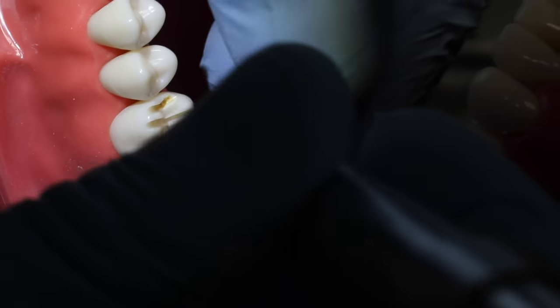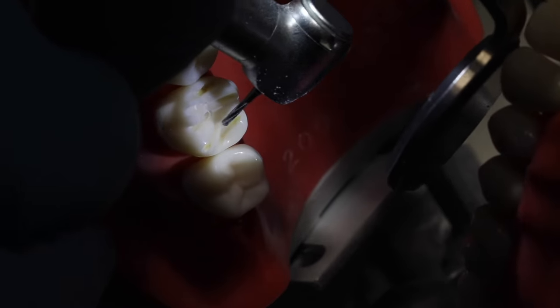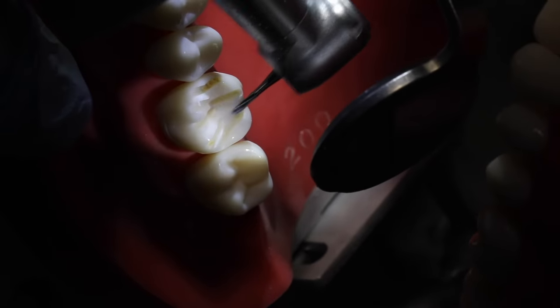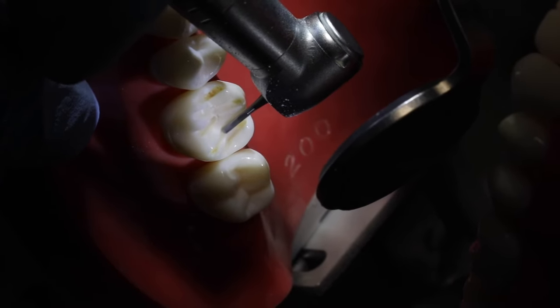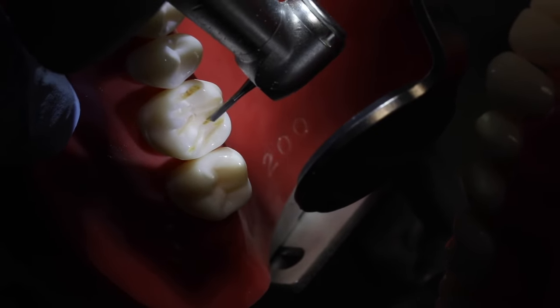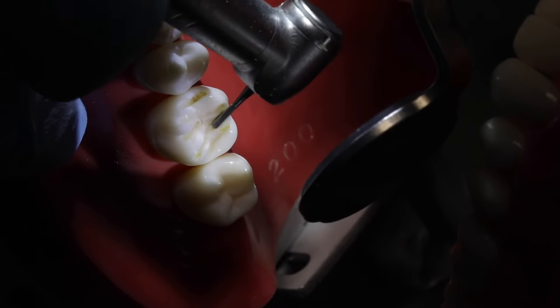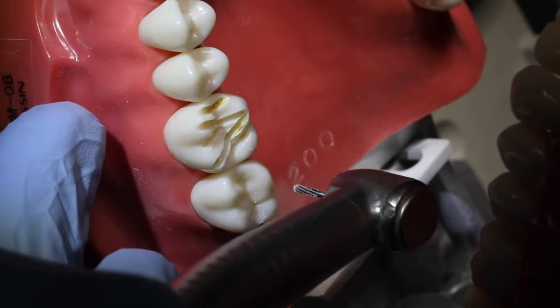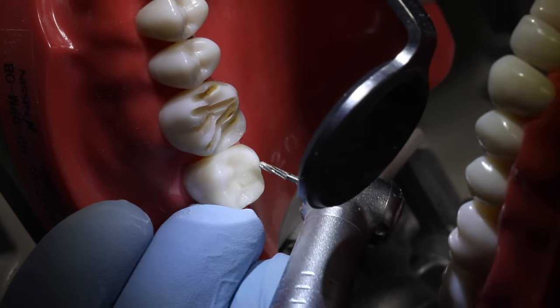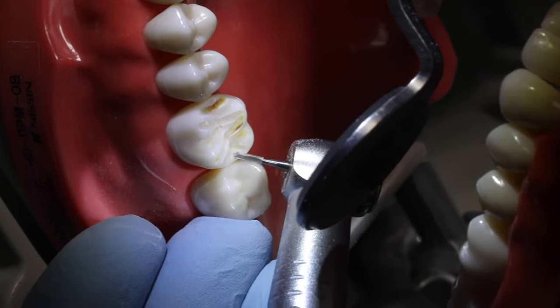I'm going to put one more guide cut on that. Actually, this may not need another guide cut along. I will do another guide cut along the oblique ridge. And it will connect with the other guide cut on the distal buccal cusp going along that triangular ridge. So just like that. And one last guide cut would be on the distal marginal ridge. Area right there.